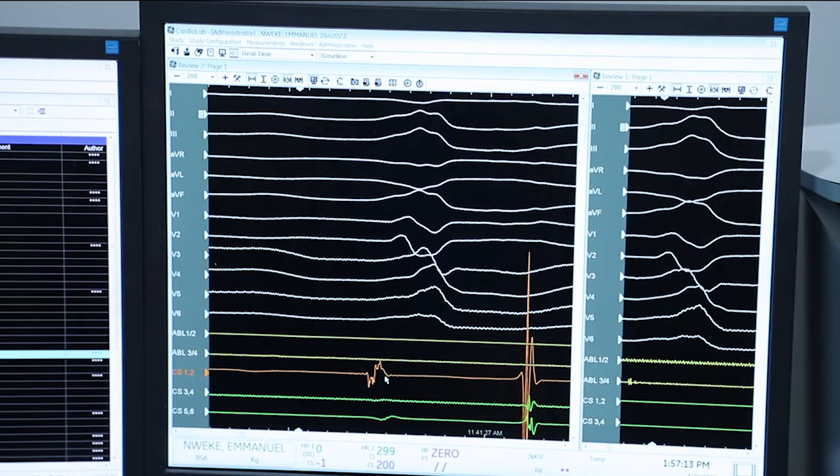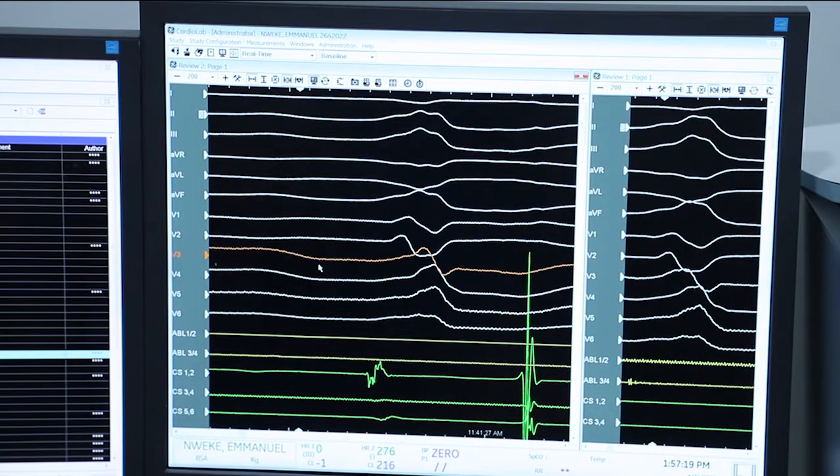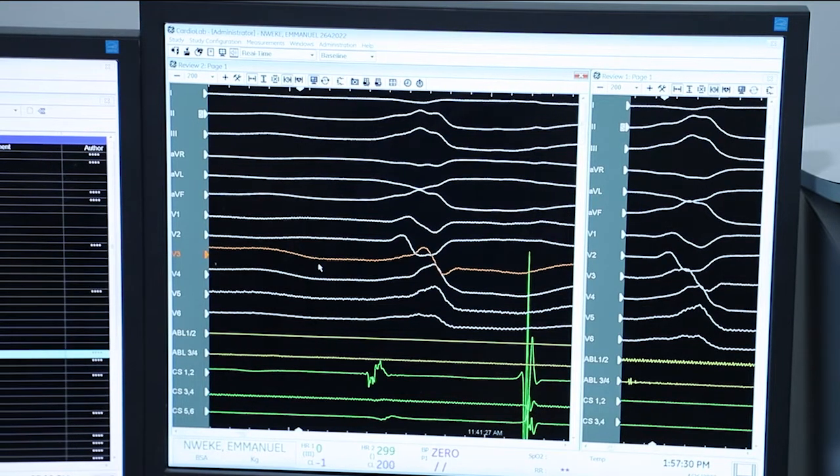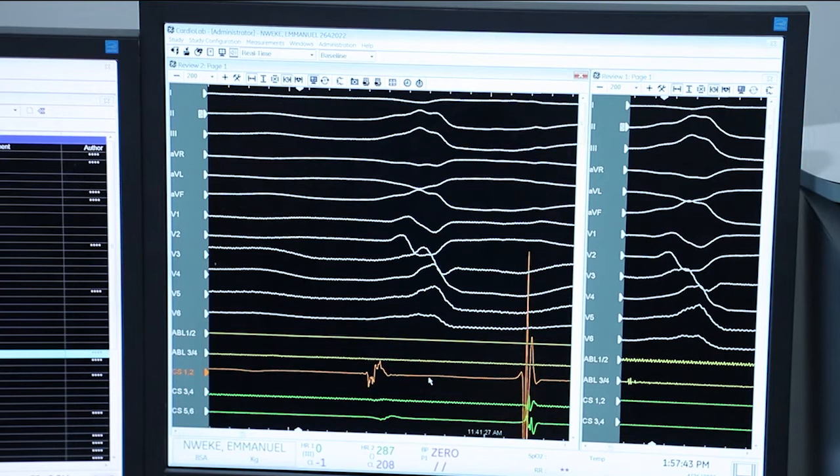So our plan is to enter into the endocardium from the LV, opposing the LV summit and the basal anterior wall, together with the left coronary cusp. All such areas we will map, and we will look for both systolic potentials, late potentials, and we will do an activation map during the PVCs.